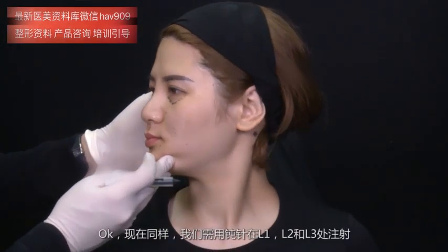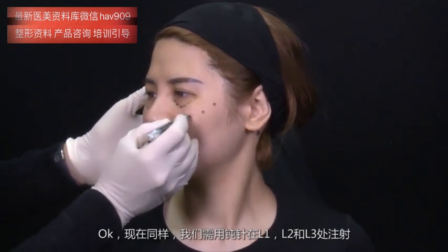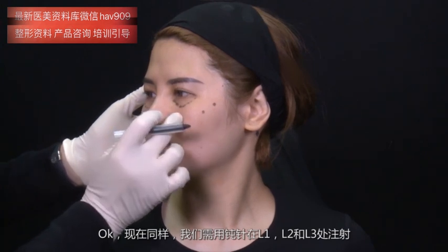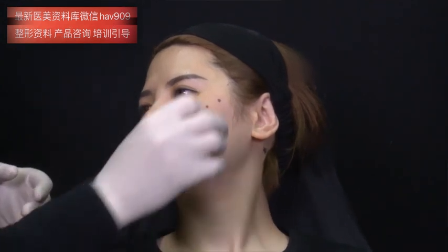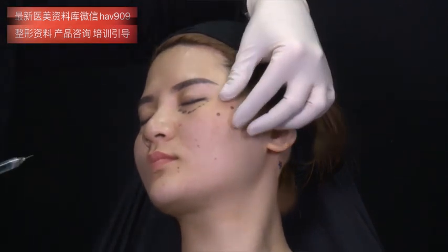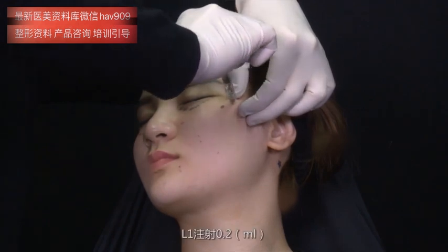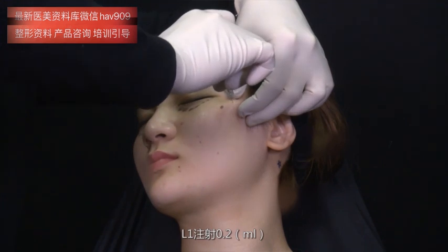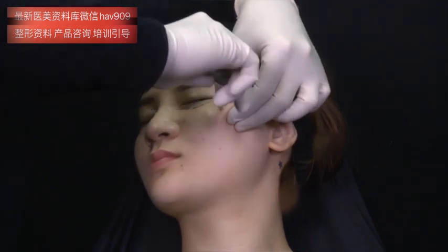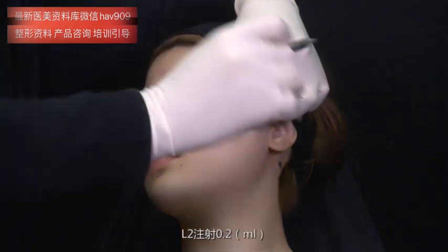Okay, let's do the same thing. L1, L2, and L3 we need to inject with a cannula. Close your eyes. So 0.2 in L1, 0.2 in L2.